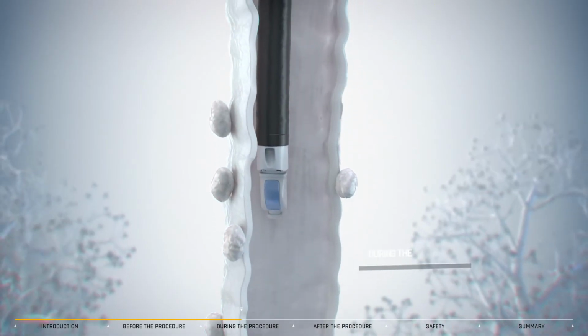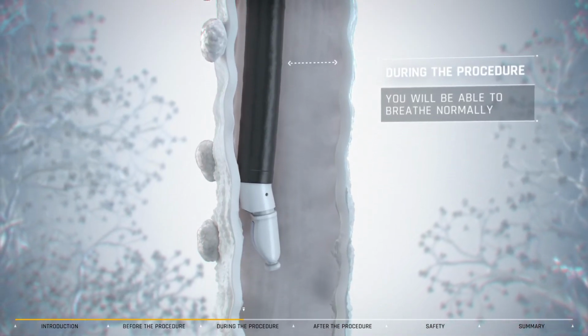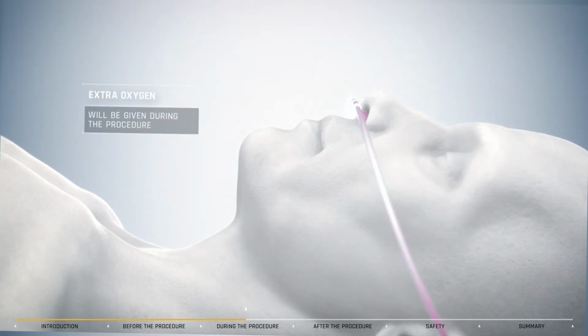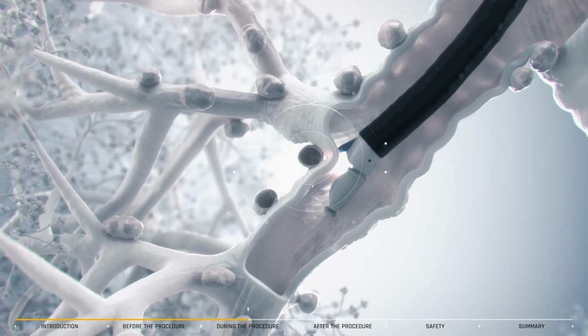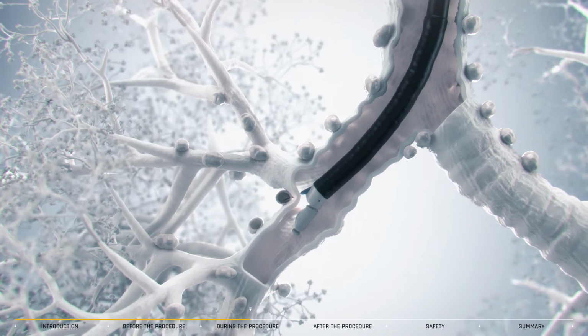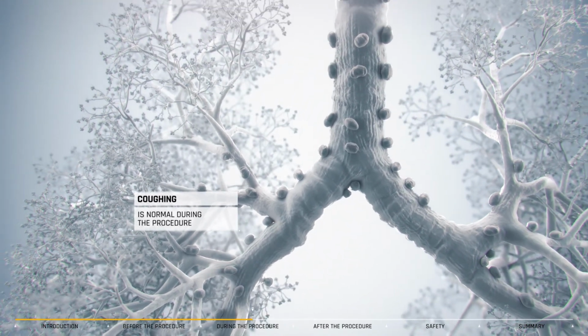You will be able to breathe normally as the EBUS scope is small in relation to the windpipe and the bronchial tubes, but you will not be able to talk. Extra oxygen will be given during the procedure via a plastic tube in the nostrils. No pain is usually felt from the inside of the lungs, even if tissue samples are taken. The only uncomfortable feeling may be coughing, which is a normal part of the procedure.